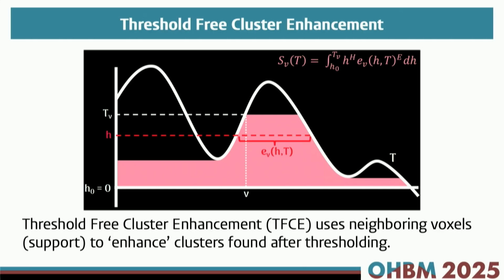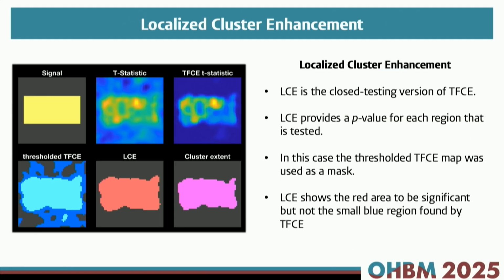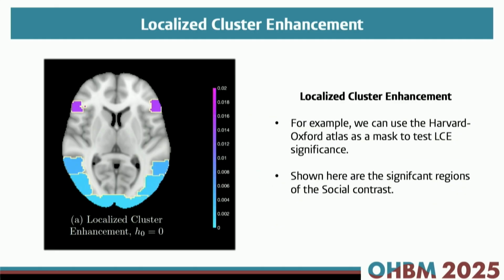If you set a threshold that is somewhat higher, the local support would be essentially much stronger, which was kind of paradoxical when we found it. But of course, this introduces the arbitrary threshold that you need to set into the equation again. Still, it can pay off to have a threshold that is not 0.